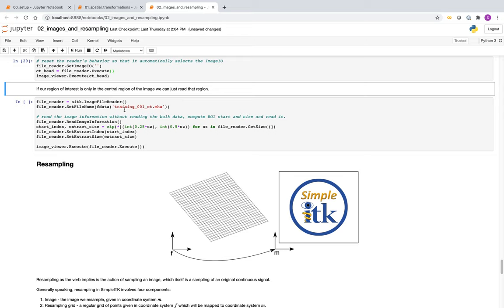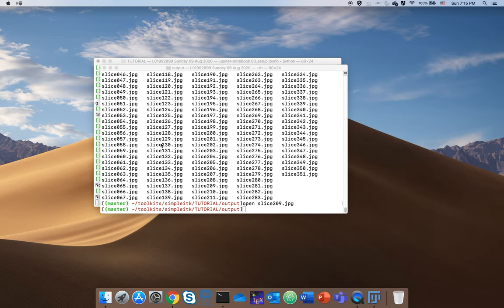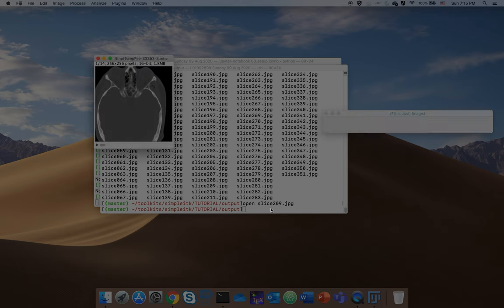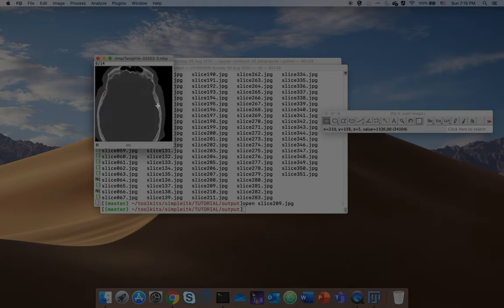For more fine-grained control, if you only need a sub-region of a large image, you can tell the reader to read only a certain region using a start index and extract size. This is much more memory efficient for very large images. Reading the same volume but only a sub-region from the center produces a cropped version of the image.